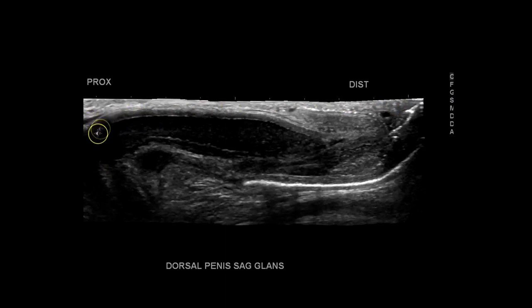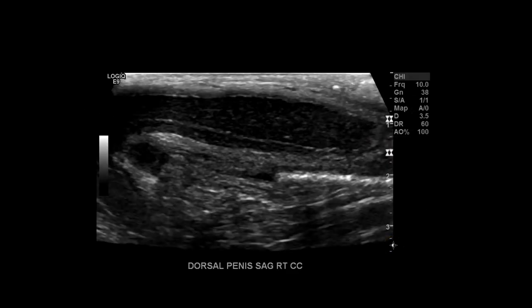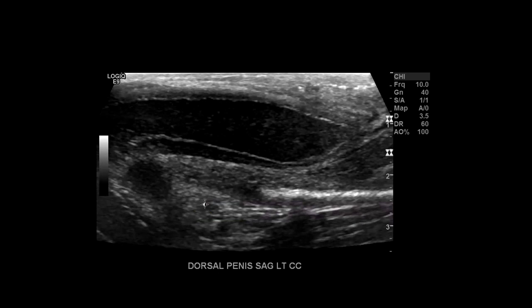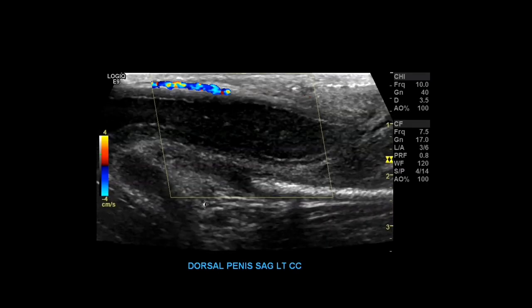Add color doppler and then a panoramic view from proximal to distal. You can see how the corpus cavernosum dips into the body, because it goes deeper than just the surface of the skin. The tunica albuginea is very intact, and here's the glans. Then I do the same with the left — proximal to distal corpus cavernosum. You can pretty much see the whole corpus cavernosum here with no defect or irregularities to suggest a penile fracture. With color doppler you'll often see the cavernosal artery within the center of the corpus cavernosum.